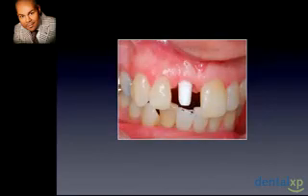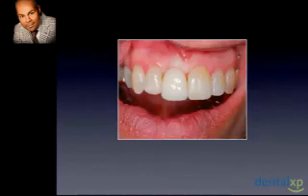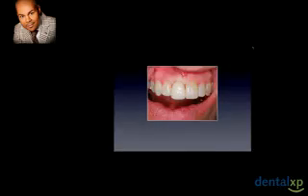Once it's healed, we'll go to our zirconia abutment, again being careful not to squeeze out our papilla. Provisionalization, you see the blanching of the tissue, and done with the design of the provisional in order to get the tissue to move coronally. And again, a technique here that we utilize is called the lollipop technique, popularized and published in PPAD in 2006 by Dr. Brian Lesage from Beverly Hills, by basically contouring the apical portion of the provisional in order to get the tissue to move or migrate coronally.